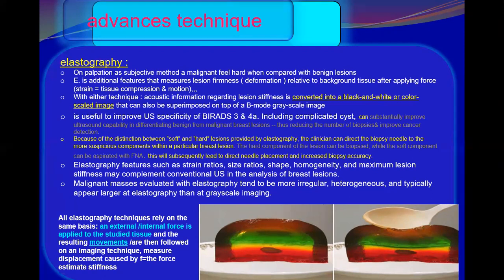But for equivocal lesions like BI-RADS 3 and BI-RADS 4A, you don't want to follow the lesion for 6 months and then find there was no need for follow-up, or that the lesion is suspicious and you have to upgrade it to BI-RADS 4, or downgrade it to BI-RADS 2, and the same for BI-RADS 4A.